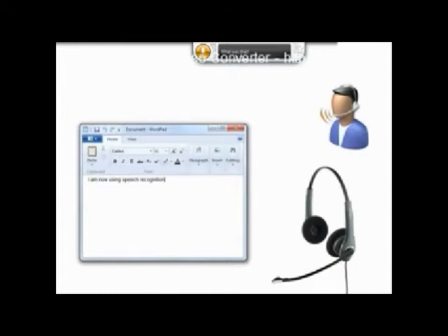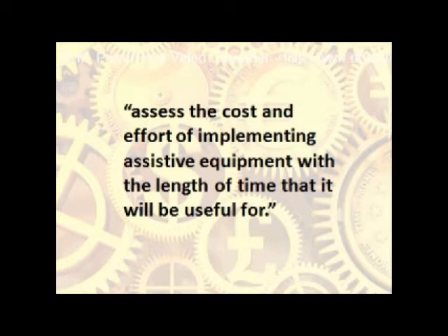I had briefly tried voice dictation software, and although it had coped surprisingly well with my slurred speech, I had to spend a lot of time making corrections. Also, I knew that it would only get worse, and it didn't really help navigate Windows applications. As with most assistive technology, there had to be a significant investment in time to set it up initially in order to get the most out of it.